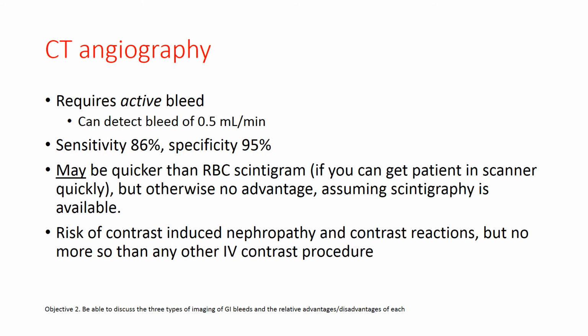Now, one thing that's available to us now that has not been available for very long is CT angiography. CT angiography can be very useful, especially if you don't have a nuclear medicine department in your hospital, or if nuclear medicine is not very available.